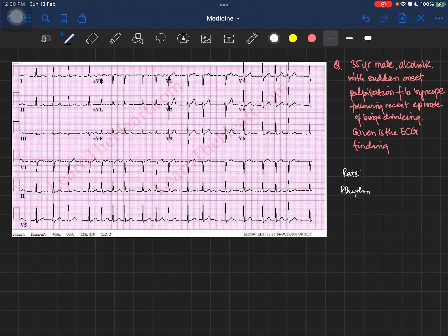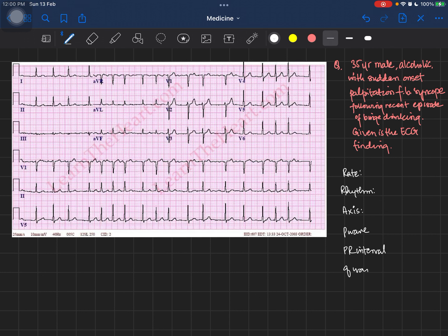We try to look at the rhythm of the patient's heart, then we look at the axis of the ECG so we can find out if the left side or the right side of the heart is enlarged — known as left axis deviation or right axis deviation. Then we look at the P wave, the PR interval, the Q wave, the QRS complex, the ST segment, the T wave, and so on.